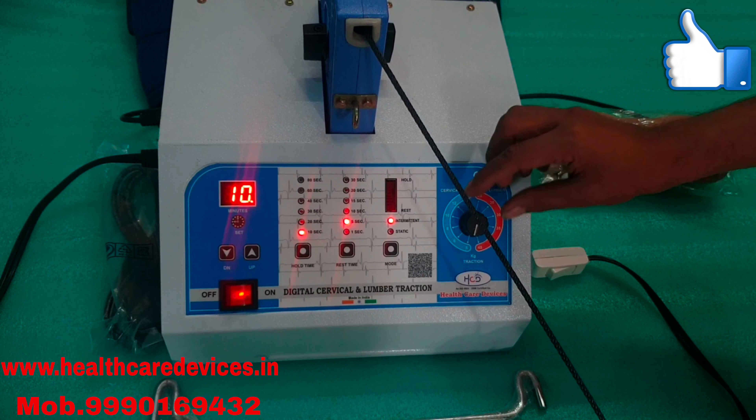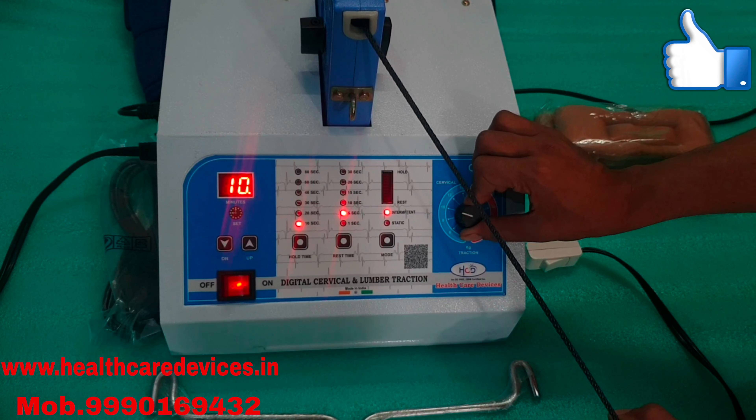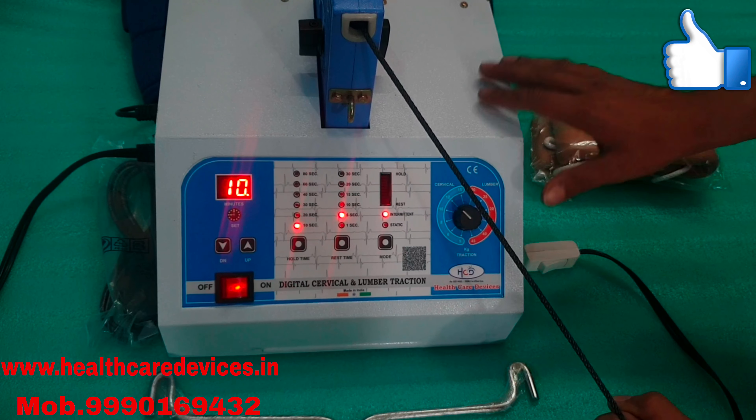5 KG — you can increase. Now we will set it to 12 KG.